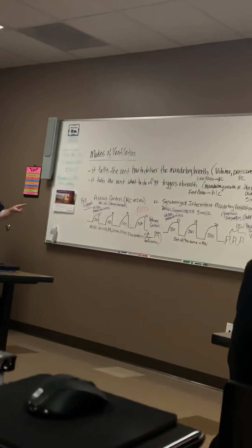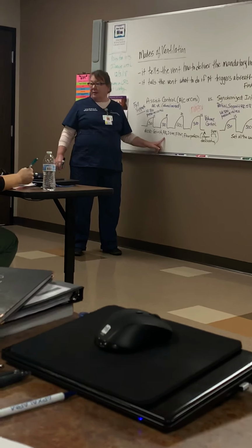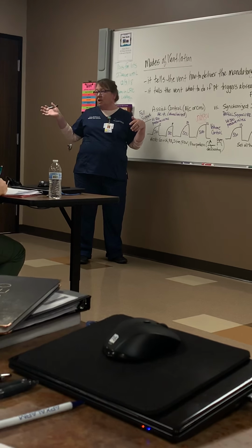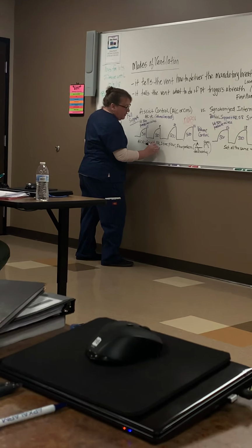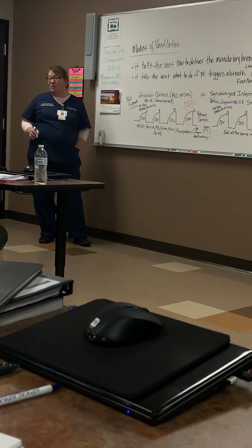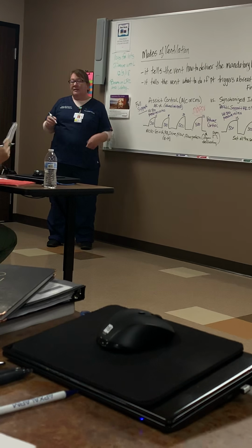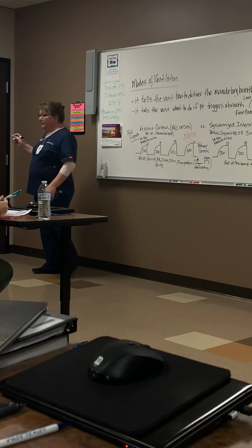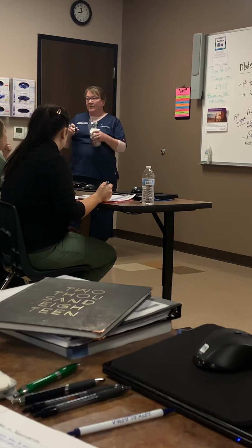And since we're talking about it, what's a good rate on the ventilator? 10 to 14 is a good starting rate. People sometimes think that my rate can be 12 to 20, not starting on a ventilator. If you're going below that, it's too low without a reason. If you're going above that, it's too high without a reason. As RTs, we love 12. Don't ask me where that came from, but most people start there, and you'll be good. You can adjust as necessary.